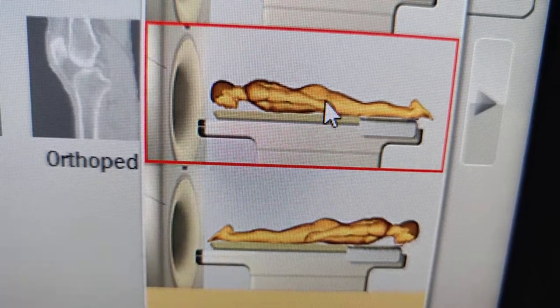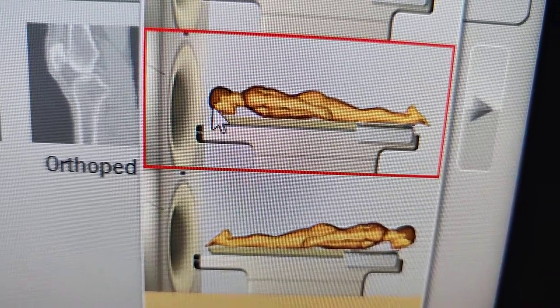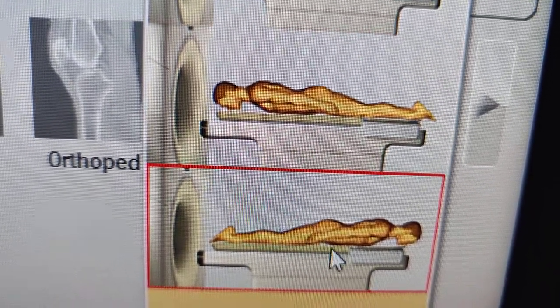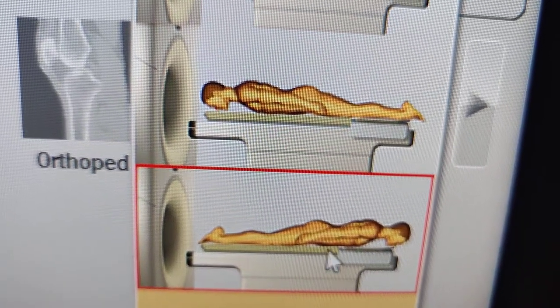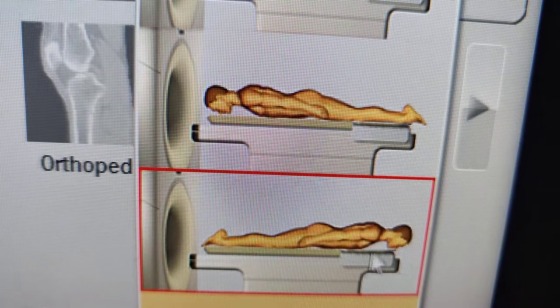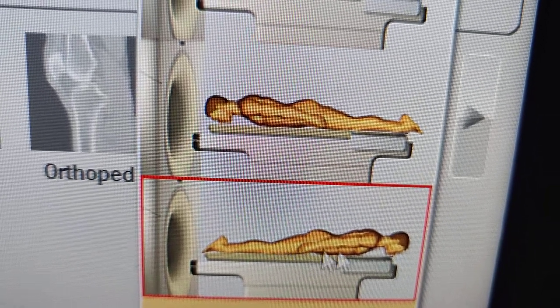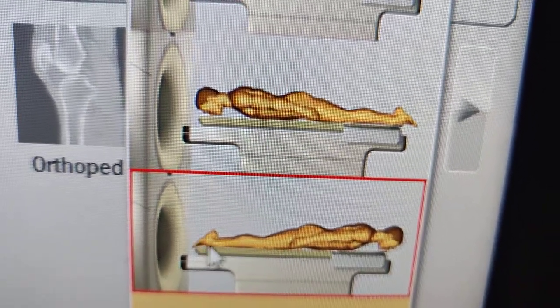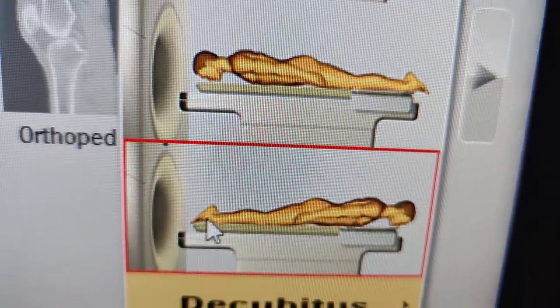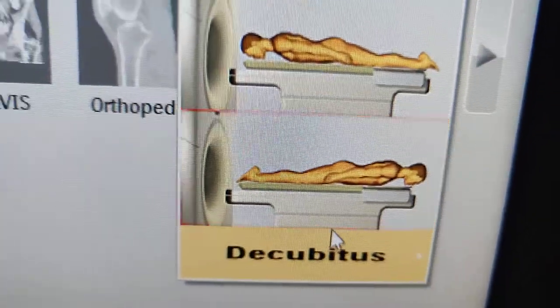So this next one is prone head first — they're laying on their stomach, on their chest, flat, face down. And this is feet first prone.